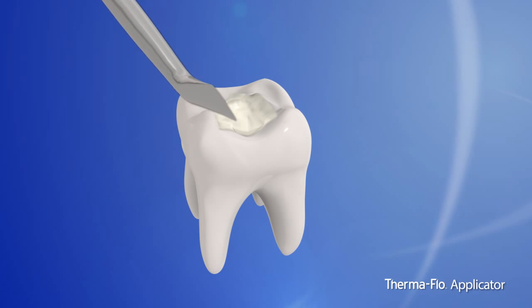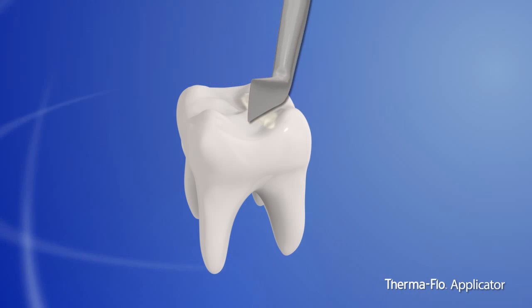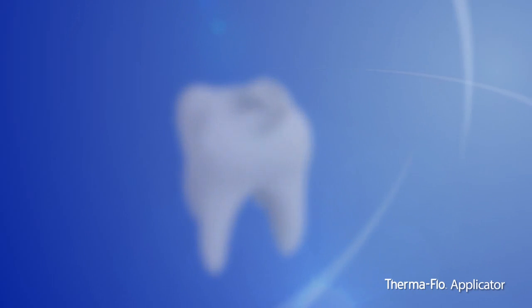Heated composite material is much easier to manipulate, making placement fast and effortless. The applicator simplifies complex procedures, saving time on each patient.